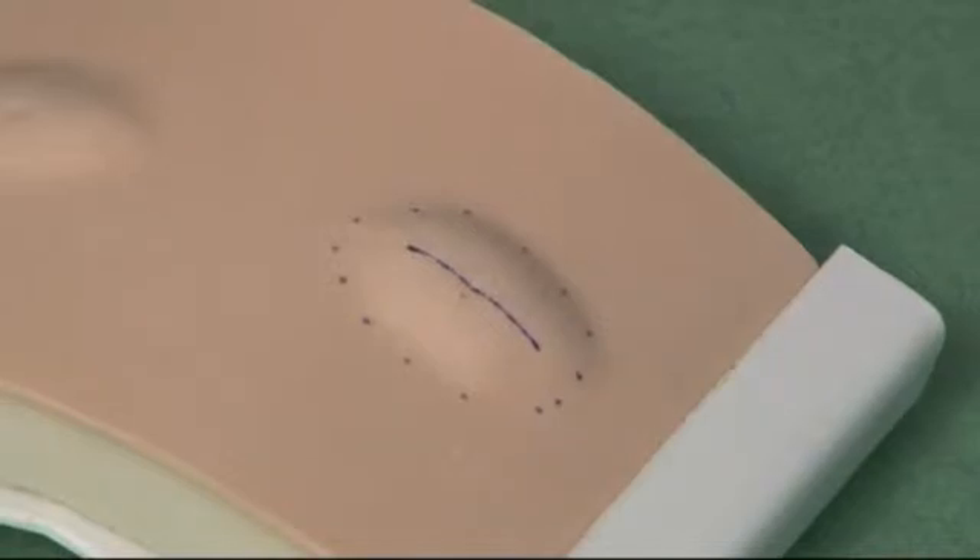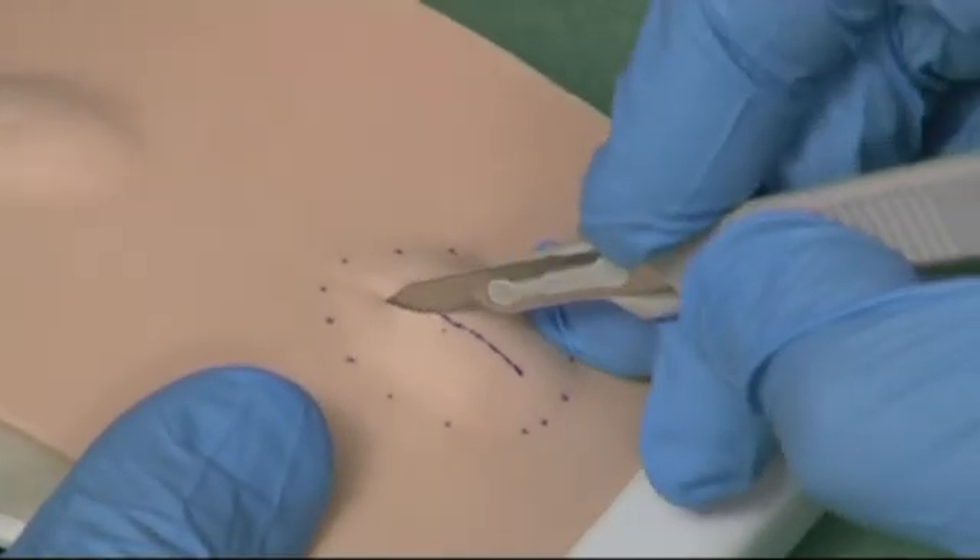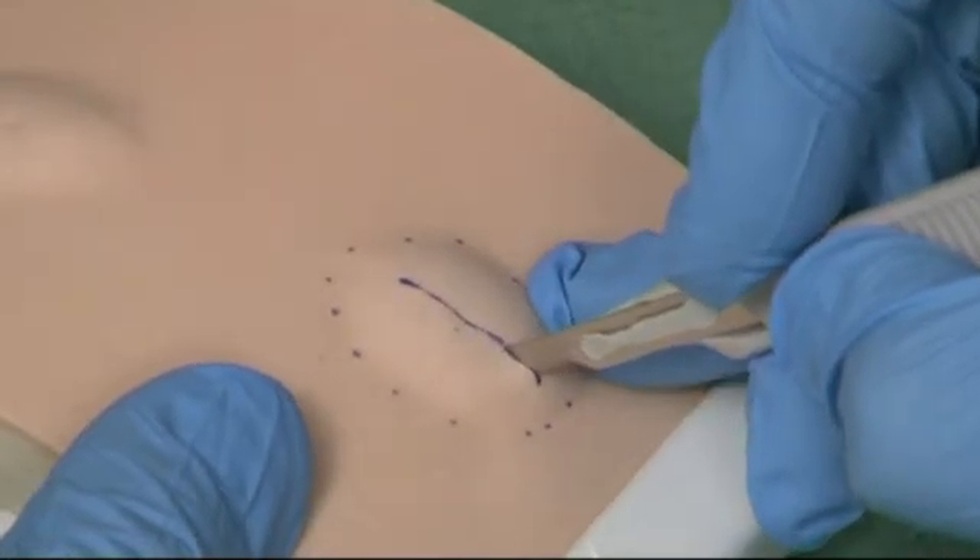Begin by using the scalpel and cut through the full thickness of the skin directly onto the lipoma, which will become visible and should extrude into the wound.